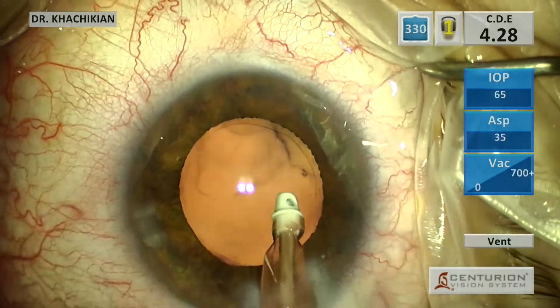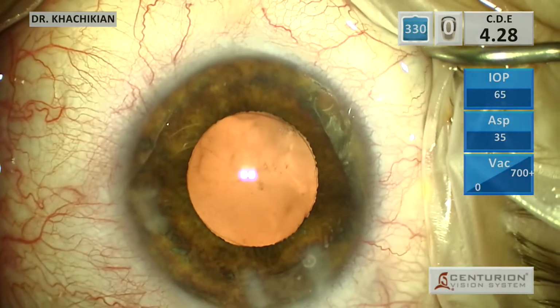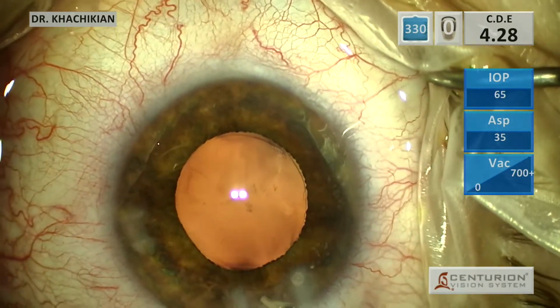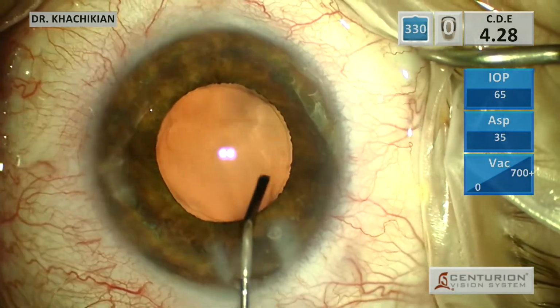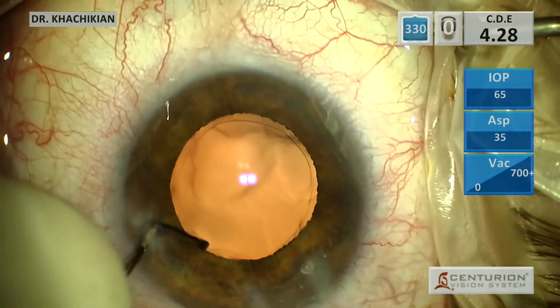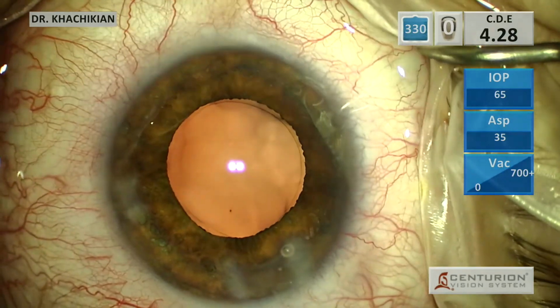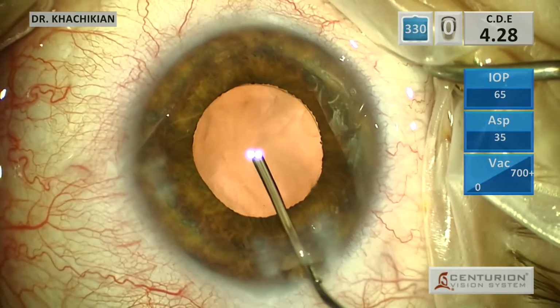And then we'll remove a few remaining strands. And then typically I will power wash the capsule with some balanced saline on a 27 gauge cannula just to get any remnants off of the back of the capsule, minimize the posterior capsule opacity perhaps. Then we will reinflate the eye with our Provisc.